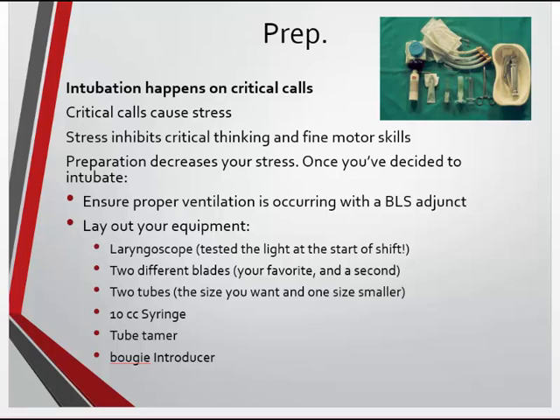Prep. Here's the deal. If you're going to be tubing a patient, chances are it's going to be a critical, high-stress call. Critical calls cause stress. Your stress kicks in. It really decreases your fine motor skills. It can inhibit your critical thinking. And if you have yourself prepped beforehand, it's going to decrease a little bit of that stress. It's going to keep you a little bit more focused. You're not going to be searching for things, dropping things, trying to find pieces of equipment that you need.